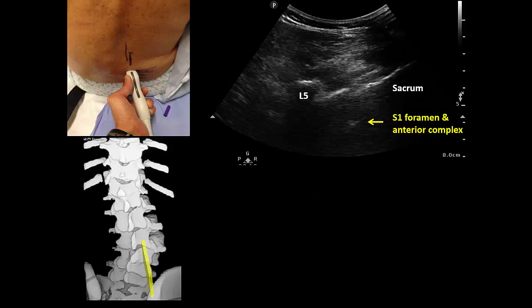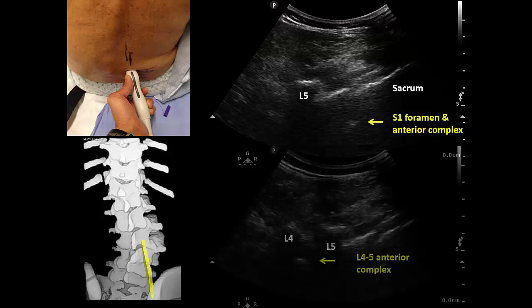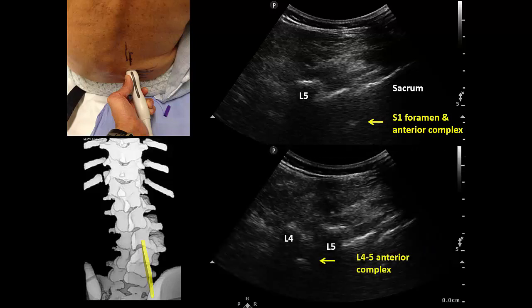Assessment of the parasagittal oblique views on the right, where we expect to find the wider spaces, shows that the L5-S1 space is almost completely closed and an anterior complex cannot be visualized. Note again the potentially misleading appearance of the first sacral foramen, which can mimic the L5-S1 junction. The L4-5 space in this patient was wider, although still narrow compared to a normal spine. Nevertheless, the anterior complex is visible, signifying a potential window into the vertebral canal.